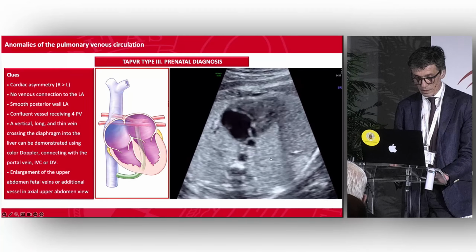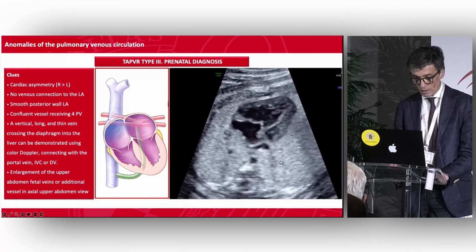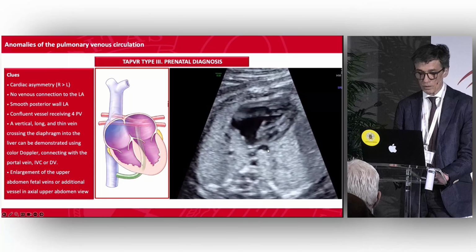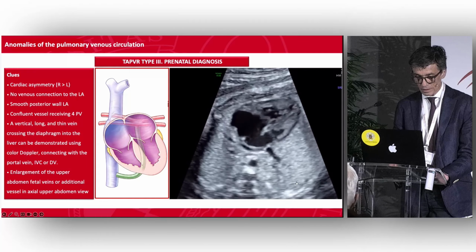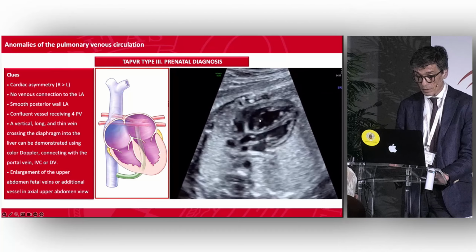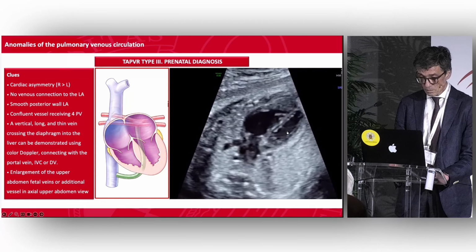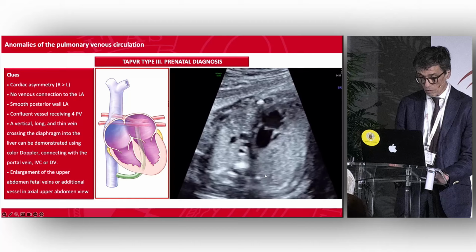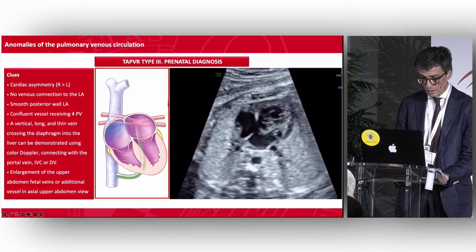And we move to the thorax, and we see these vessels behind the left atrium that receives some vessels from one lung and from the other. This is the aorta, and you see this collector receiving. We will put now the color Doppler to see that these are vessels and not another structure. This is in the context of a usually apparently normal heart with only the right side larger than the left side. This is the pulmonary artery, pulmonary valve. The aorta is smaller than the pulmonary artery.